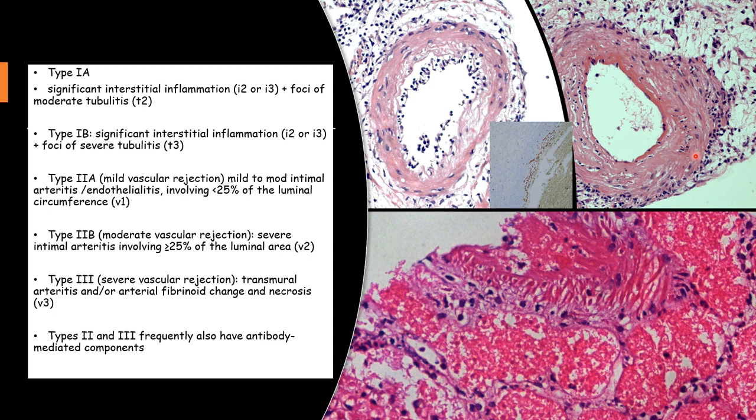The blood vessels also get affected, and you can see in this slide that there are a large number of lymphocytes which are present just below the endothelial cell lining of the vessel. Even one lymphocyte is adequate for us to label this condition as endothelitis. And you will see that all the cells have marked with CD3, suggesting that these lymphocytes are T lymphocytes.